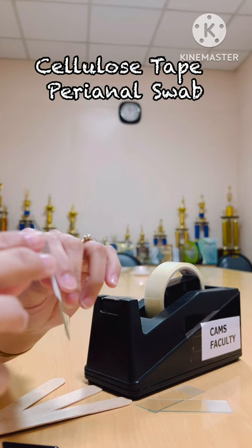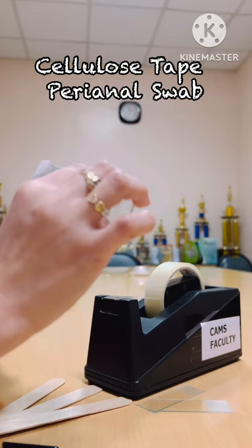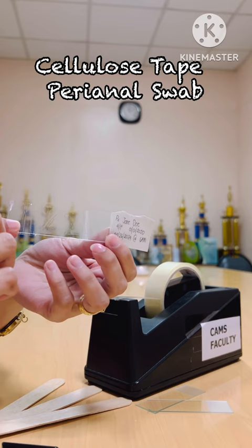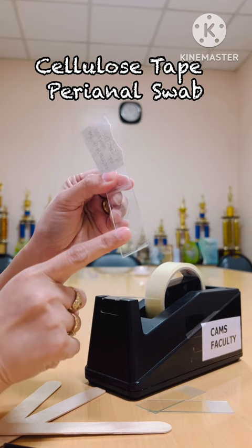You can also cover the back portion of the label so that it's fully secured and you will not be able to tear it. So the back portion is three-fourths only, and then the front portion is all the way through. Next, we need to get the tongue depressor, because that is where we will be placing the scotch tape.